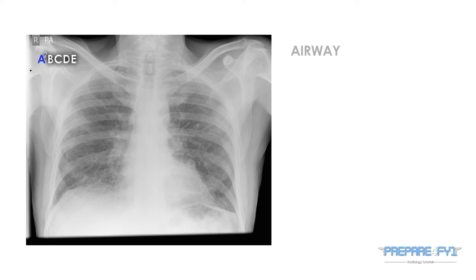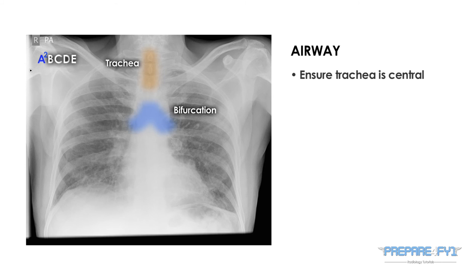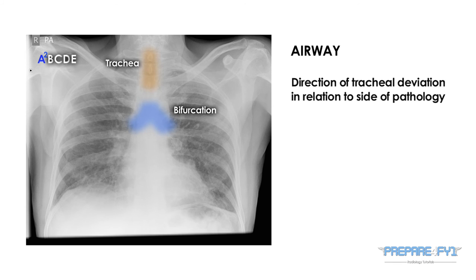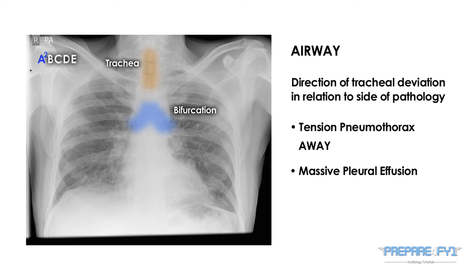The second A stands for airway. The trachea is visible here and you would expect to see the bifurcation of the trachea as illustrated. You should look to see the trachea is not deviated to one side or other and, if it is, consider the pathologies that may have caused it. These may include tension pneumothorax with deviation of the trachea away from the side of the pathology, massive pleural effusion with once again deviation away from the side of pathology, and collapse with deviation towards the side of the pathology.